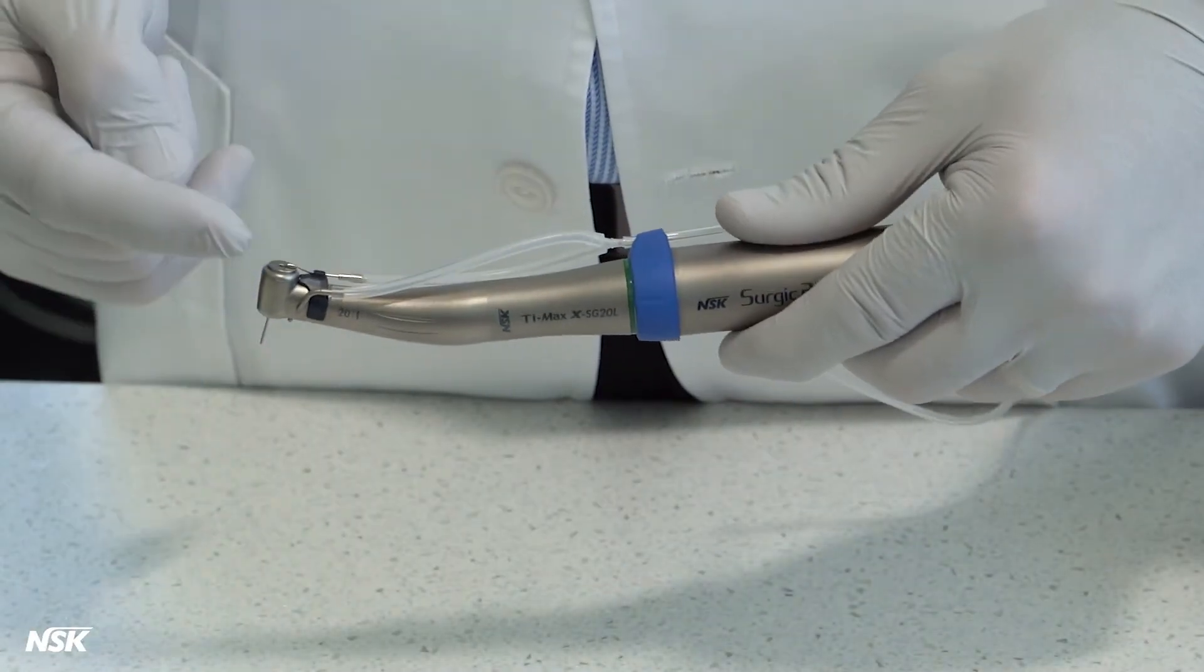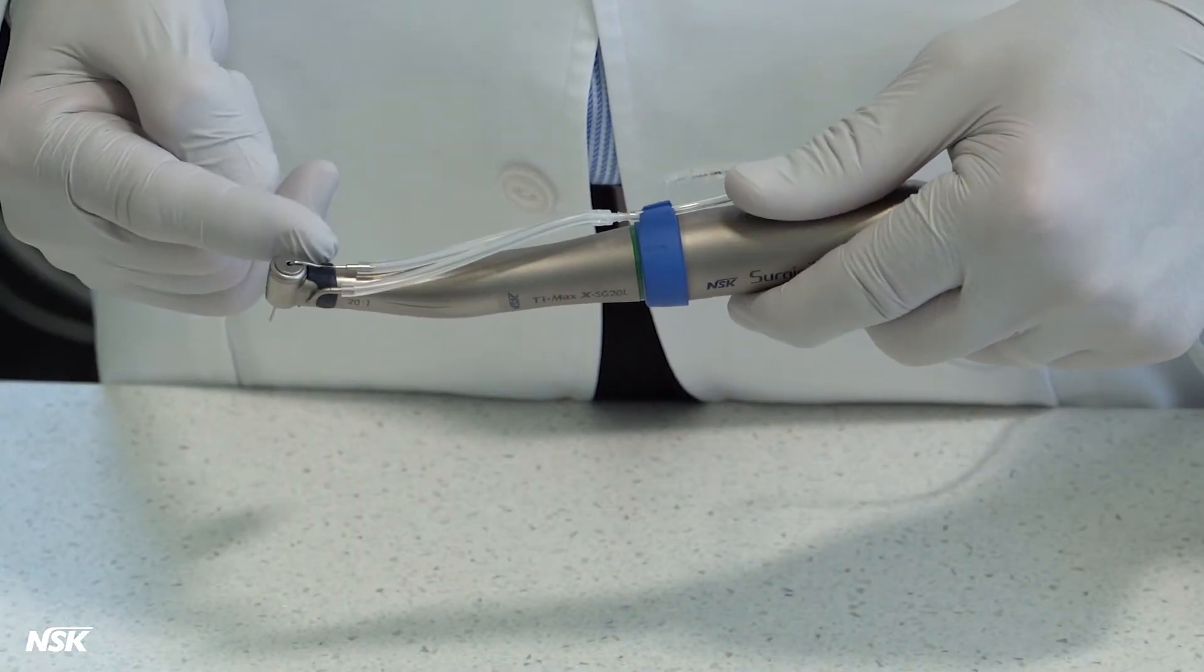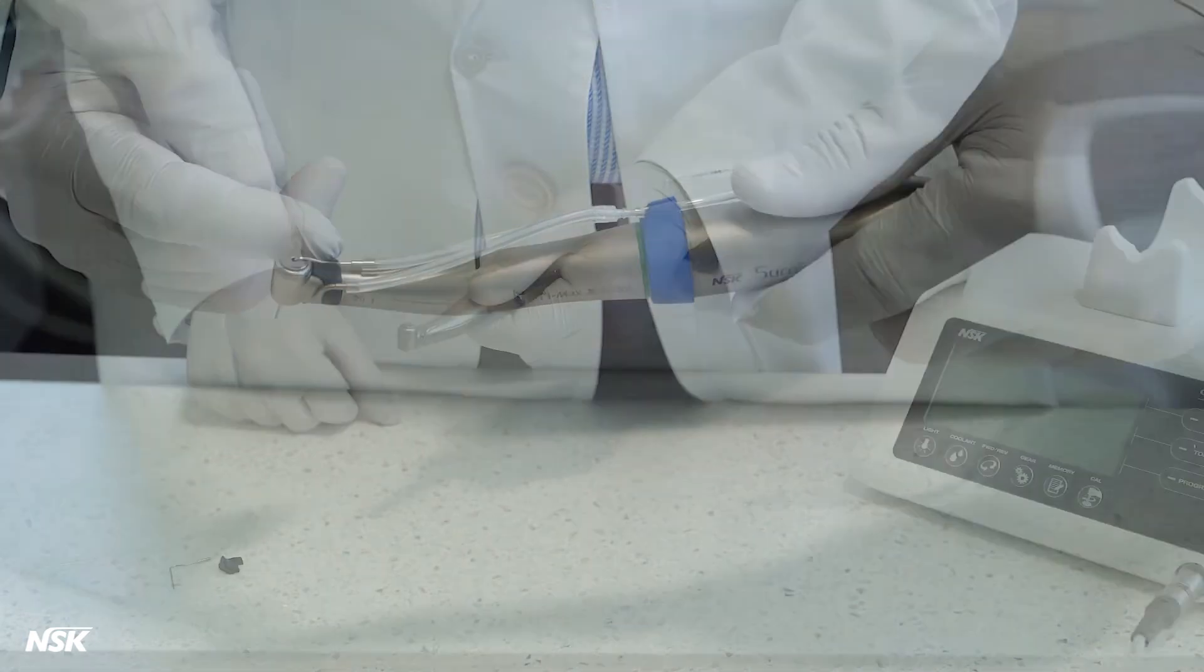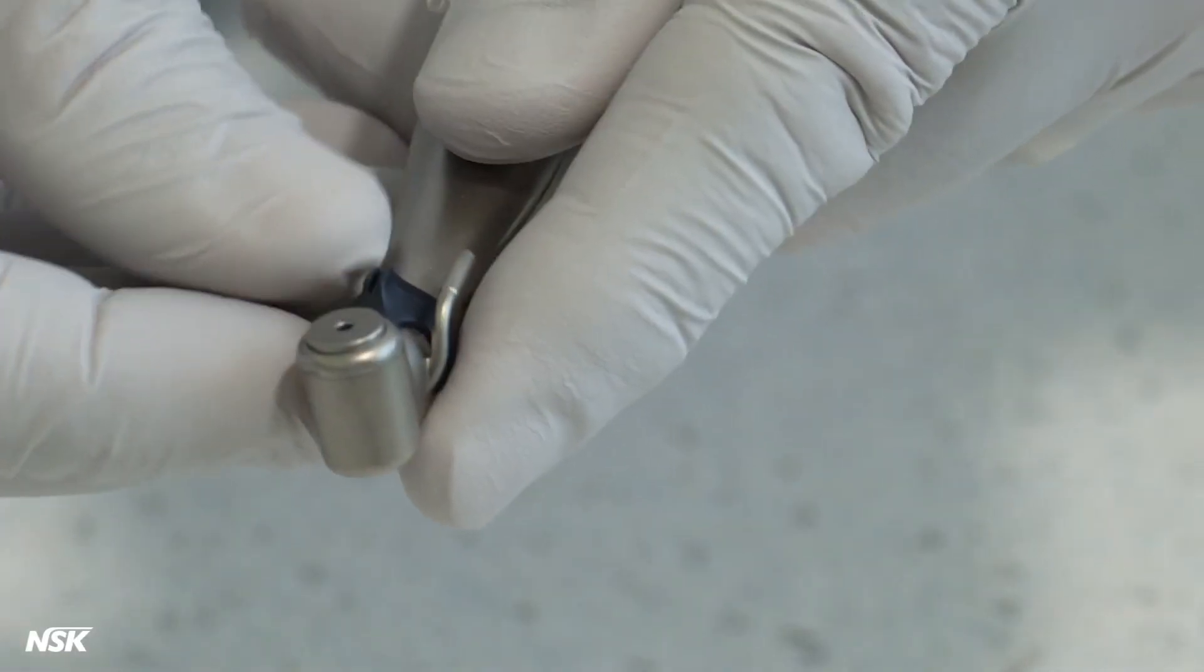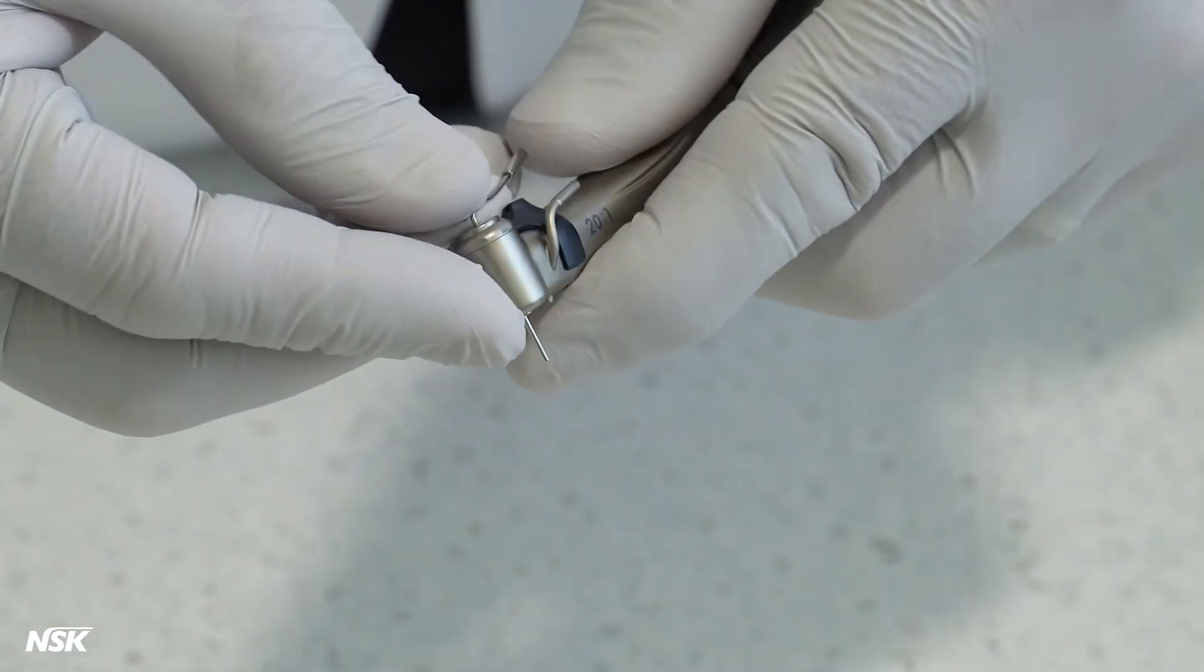If you need dual irrigation, use the internal spray nozzle in addition to the Y connector. The internal spray nozzle is mounted on the neck of the attachment. Using the black holder, with a slight push, it will click into place.